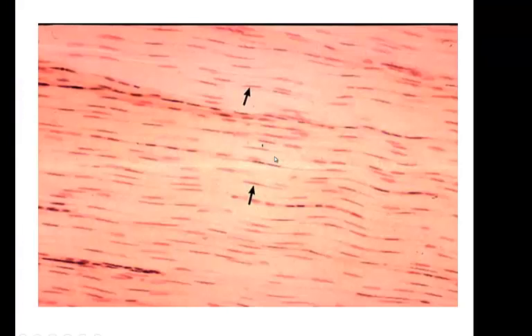Here's another picture of dense regular connective tissue. You can see how this picture and this picture might not look anything alike to you, but they are the same tissue at different magnifications. These are all pictures of tendons and ligaments. It's all dense regular connective tissue, and the unifying factor would be the collagen fibers running in one direction and these slit-like nuclei of the fibroblast. So here it is again, and here it is again, just up close. Here's a fibroblast nucleus, a fibroblast nucleus, a fibroblast nucleus, and a fibroblast nucleus. And here it is again and again and again.